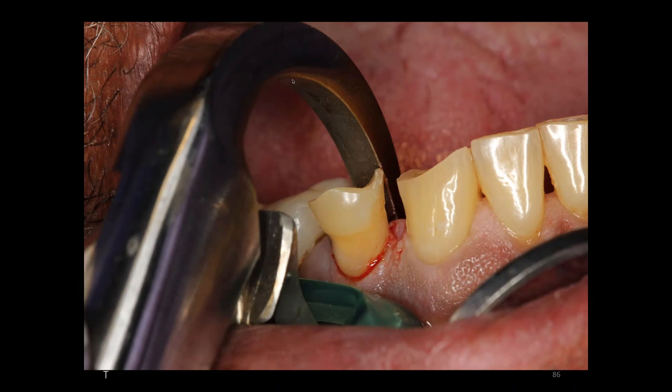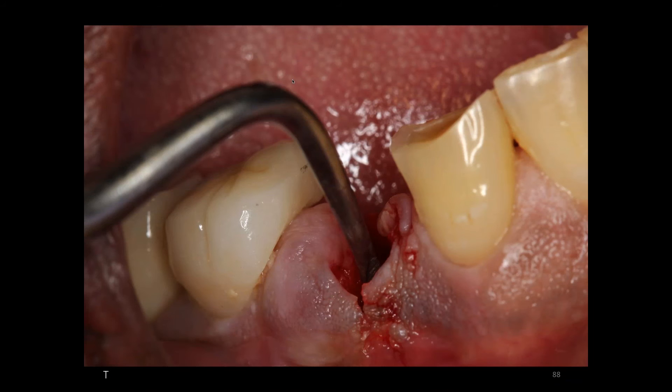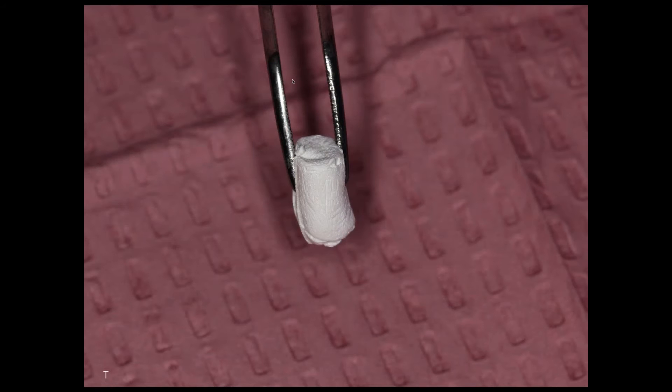This is what the Osteogen plug looks like — it almost looks like a piece of chalk. It is malleable to some degree and it can be cut. There are two sizes: a thick and a skinnier one. I'm simply taking this product to the site and pushing. What's unique about this product is that as it absorbs blood, it takes the shape of the socket itself. Wonderful product.